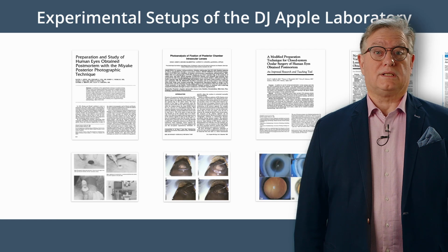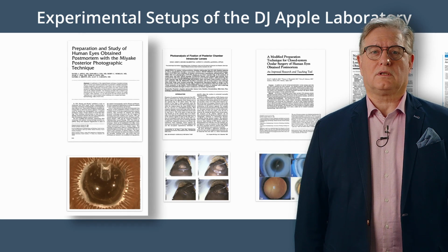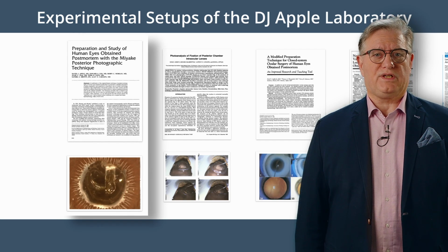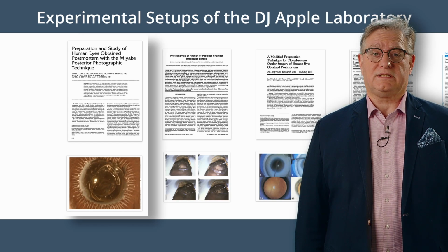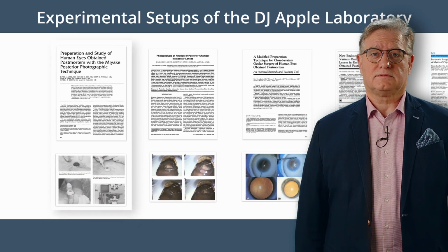At the David J. Apple Laboratory, over the last decades, several techniques were developed to look inside the eye using human autopsy eyes, evaluating new implants and new surgical techniques. The first and most famous technique is the so-called Miyake Apple Posterior View video technique, where you can see the capsular bag and the zonules and the ciliary body from behind.